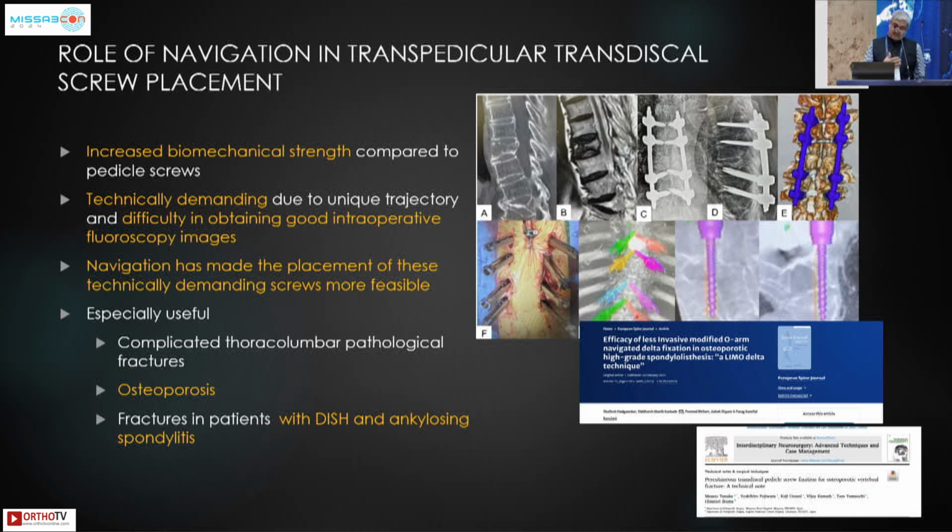So having said all these things, gradually our indication of O-arm navigation is increasing. And in future, I think with virtual reality, artificial intelligence and the amalgamation of the neuromonitoring with the navigation, it's going to make it safer.